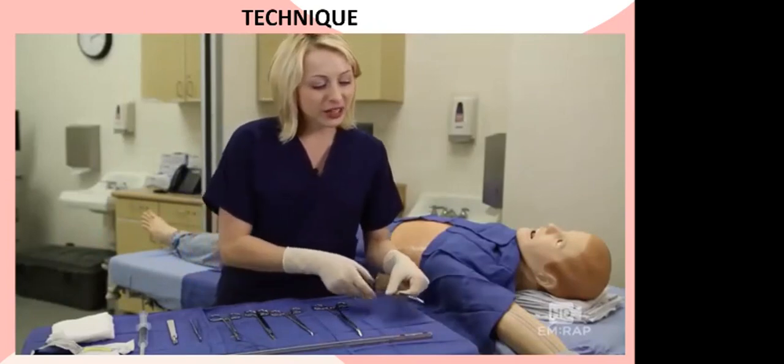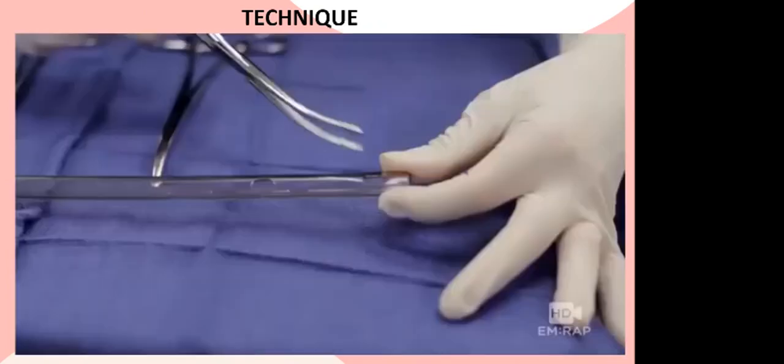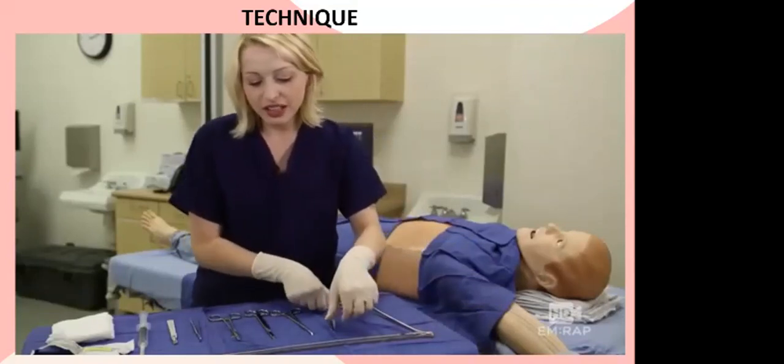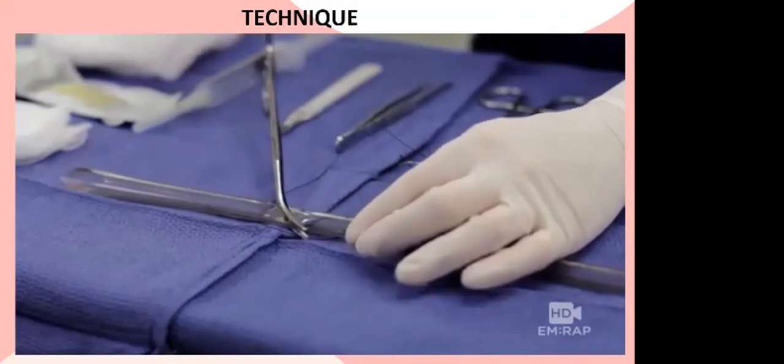Take the large Kelly clamp and clamp the tip of the tube. Some people alternatively will go through that distal hole. There's no right or wrong answer. Take the second Kelly clamp and clamp the other end of the tube to prevent fluids from gushing out.